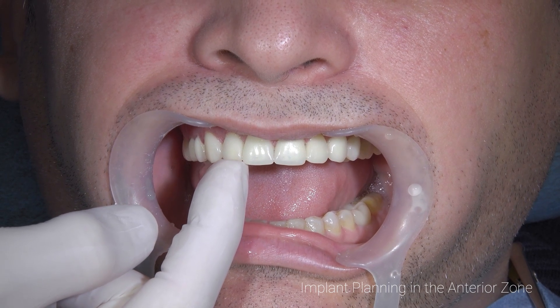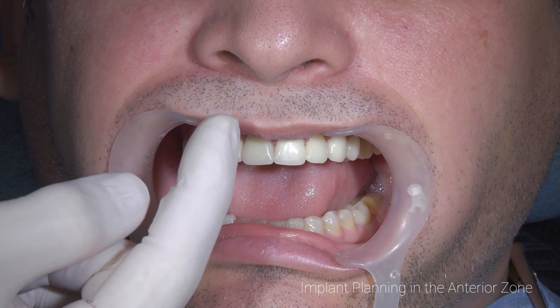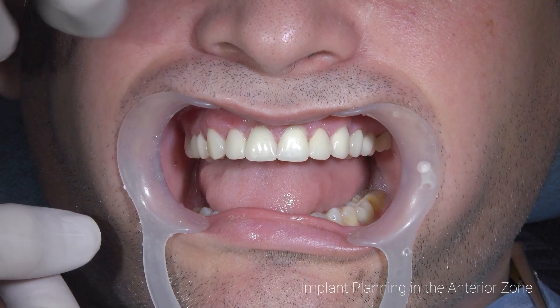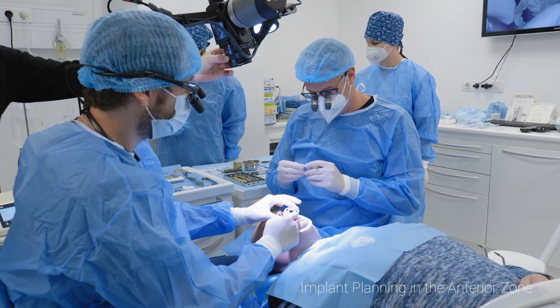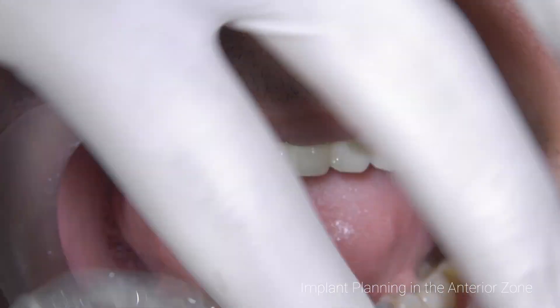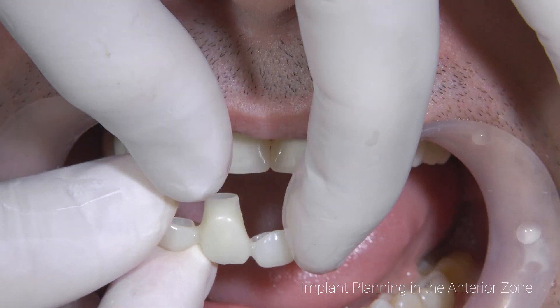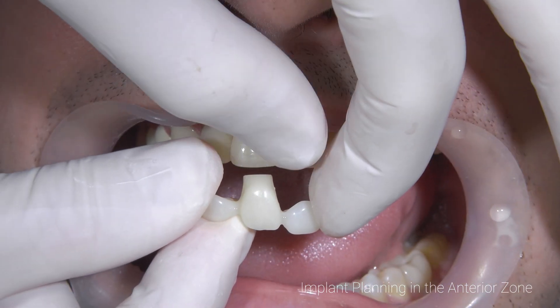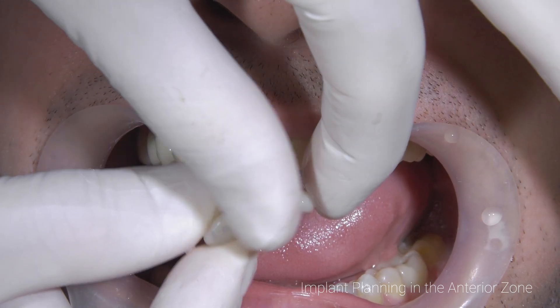We have bone for that, so it's nice. I have my implant four millimeters away from the gingival level — this new gingival level. We need to remove all the provisionals and start. We also did the provisional in the lab as discussed yesterday, so I asked Joanna the technician to do this provisional.